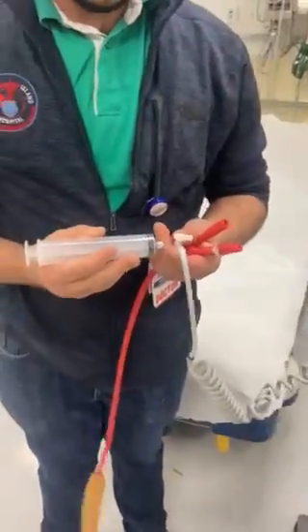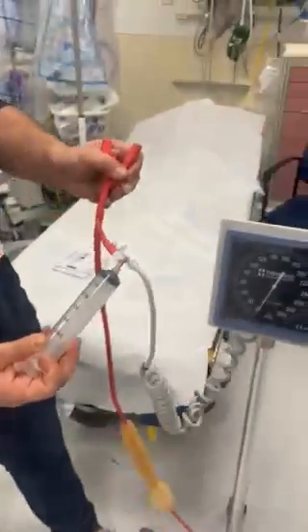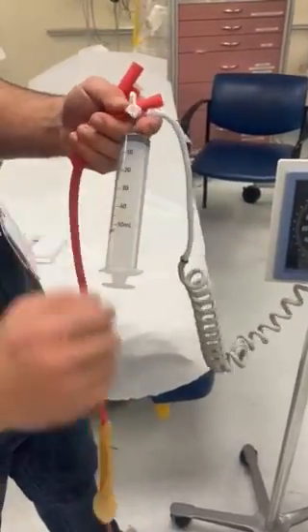You've got the 50cc syringe, and it's going to be set up like this: esophageal balloon on one side, cuff on the other, 50cc syringe on the bottom.